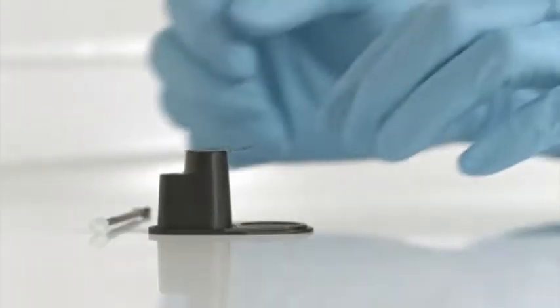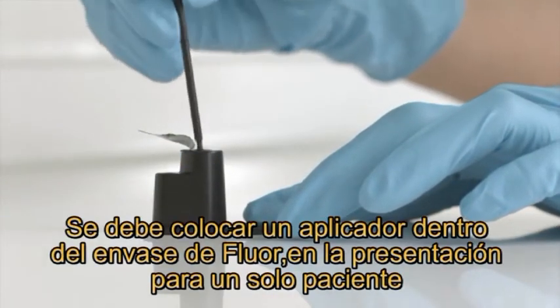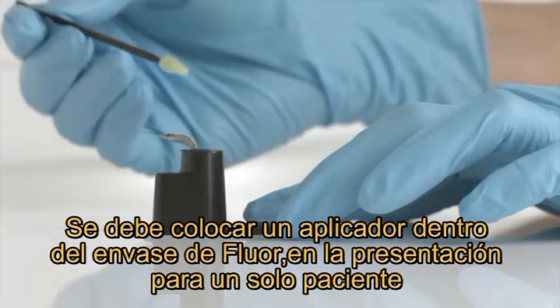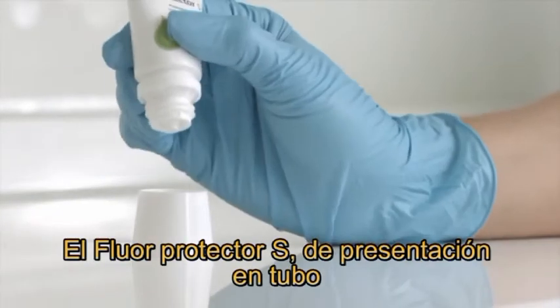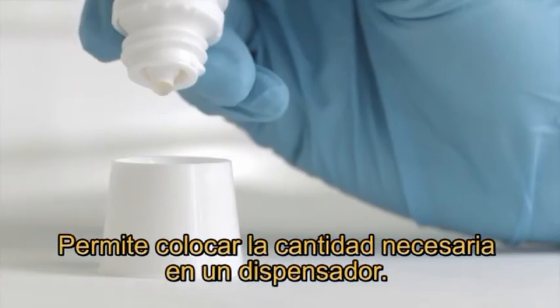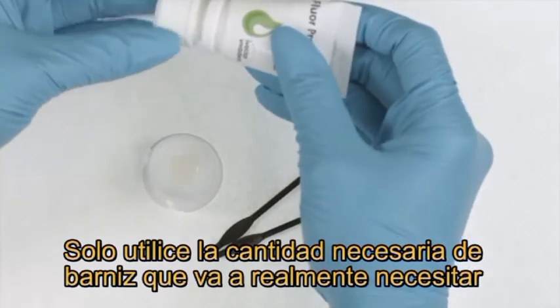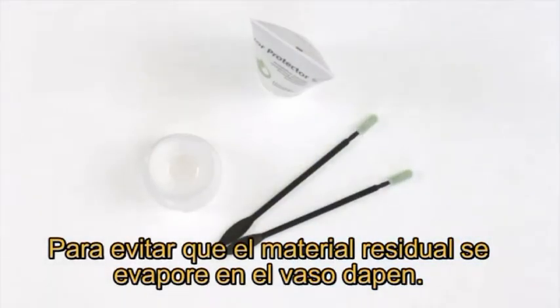Remove the required quantity of varnish. It is recommended that you briefly dip the applicator into the fluid once if you use a single dose unit. The Flor Protector S tube enables you to dispense the material exactly in the desired quantity. Only use as much varnish as you really need, to prevent residual material from drying out in the dappen dish.